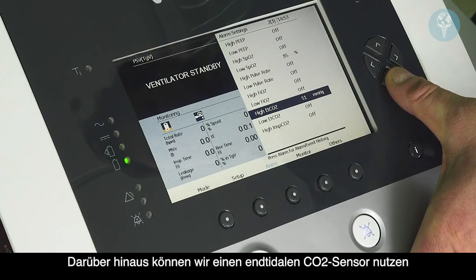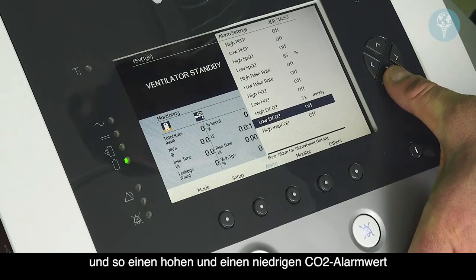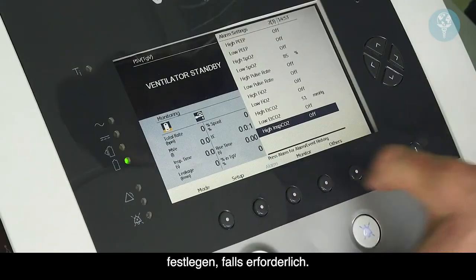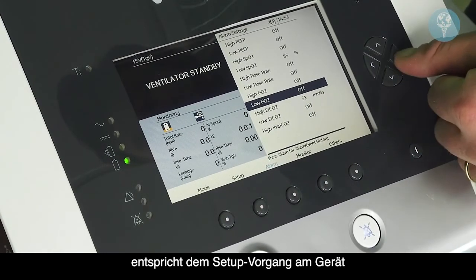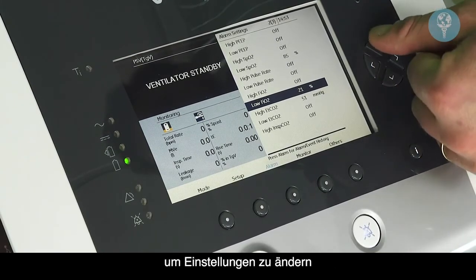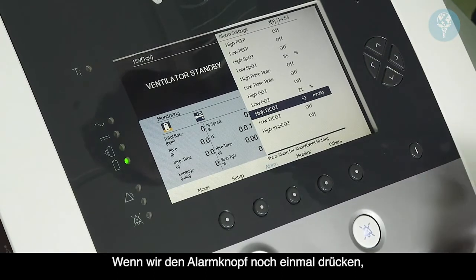We are also using the end-tidal CO2 sensor, so we can set a high and low end-tidal CO2 alarm value and also a high inspired CO2 alarm setting if needed. The way that you change these alarm settings is identical to how we've set the device up and changed the first page of the alarms. You use the left and right buttons to change the setting, and then up and down to toggle through the list.